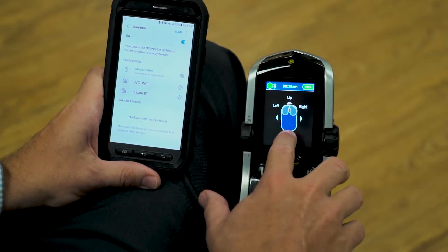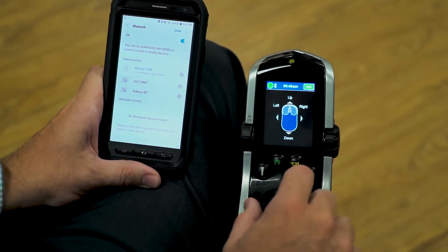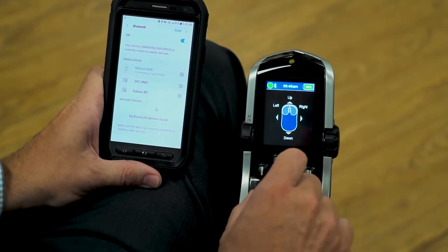Now, the electronics on the wheelchair — the mouse has turned blue, and the top bar is blue. That shows me I'm connected, so I now have the ability on the phone to control the mouse cursor.